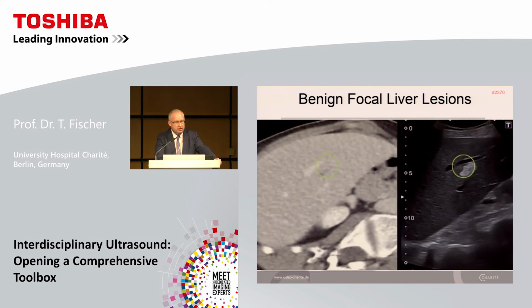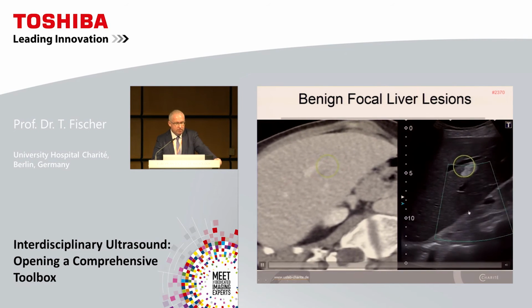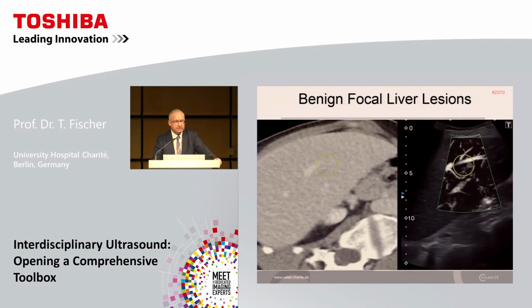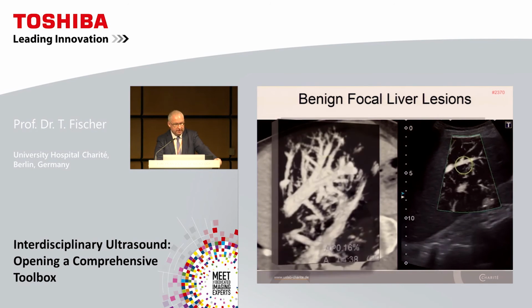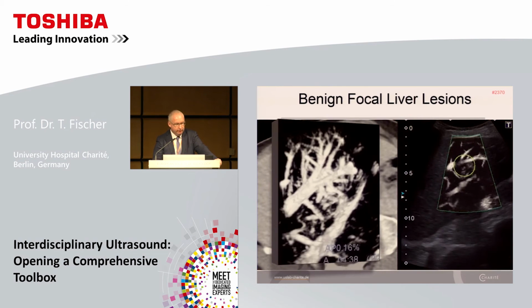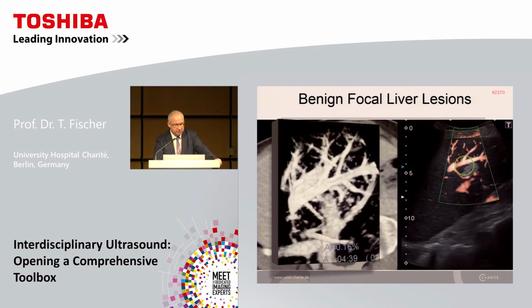If the lesion is smaller, detected by a staging CT on your left, we see, once again, a beautiful hyperechoic lesion in B mode. We switch back into SMI, color SMI, and move on to monochromatic SMI. Look at this, beautiful to visualize the feeding architecture of this special lesion. And of course, this is a diagnostic overkill. We can reconstruct everything three-dimensionally now. So I love these images, of course, also for demonstration.